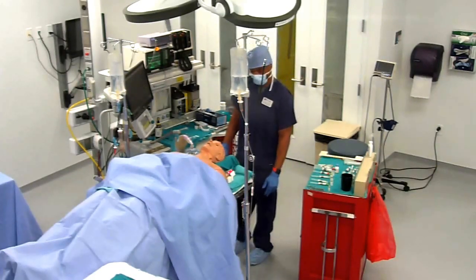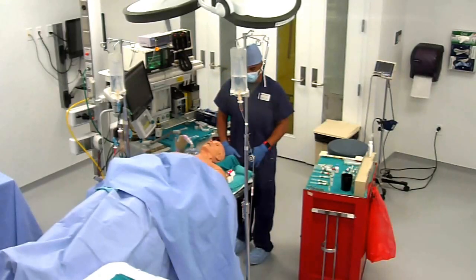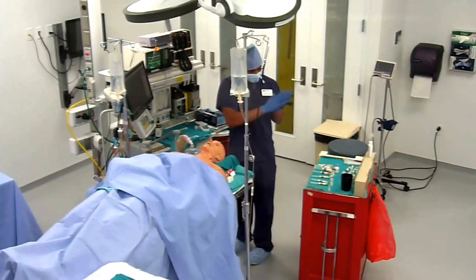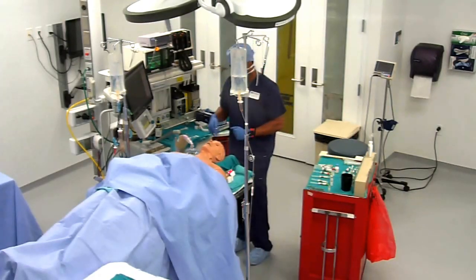Hello. I see you've got gloves on. Oh yes, I got my protective equipment on: booties, gloves, mask, hair cover, and surgical scrub attire is on. And I'm sterile. Did my hand washing before I came in. Is there anything else in the PPEs that you should have? Mask, eyes, well, mask, face shield, hair. So your eyes are protected? Eyes are protected. Okay. Yes. Face shield.